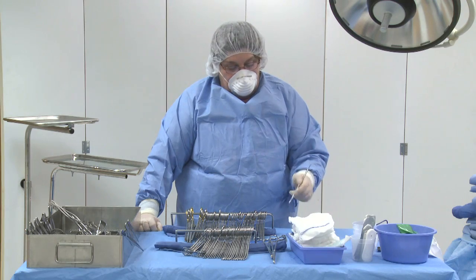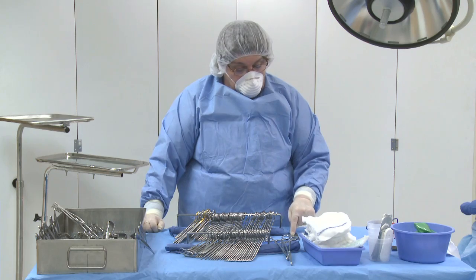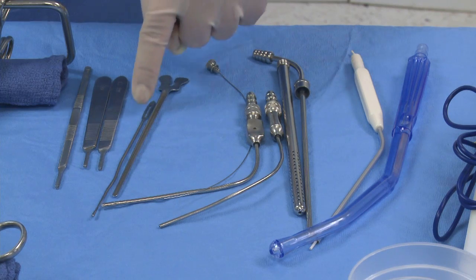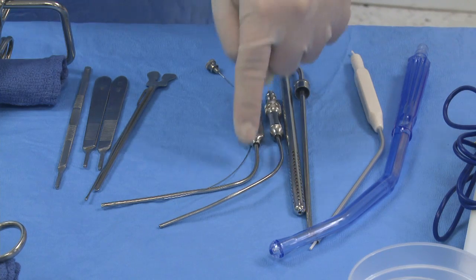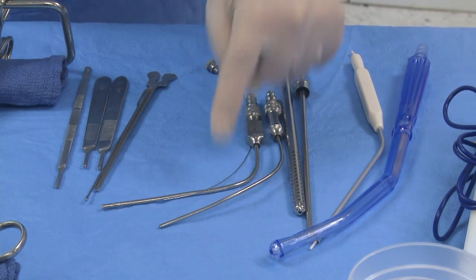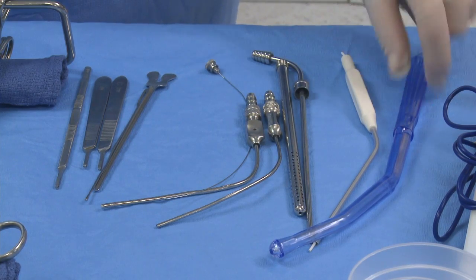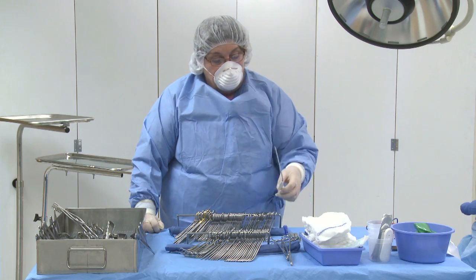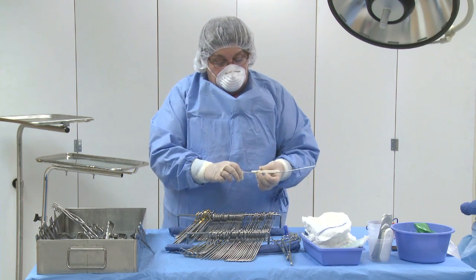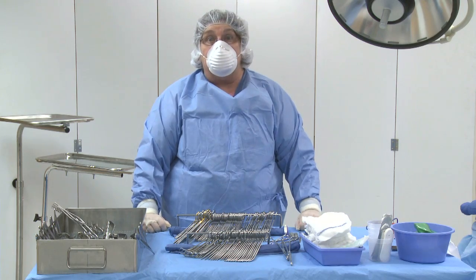Now we're going to count the rest of the instrumentation. You have 1, 2, 3 knife handles. The probe and the groove director. The two Frasier Neuro suctions with stylet. The pool suction with two pieces. The two disposable suctions. The plastic Yankauer suction. And the plastic Neuro-Frasier suction and the stylet. And we have completed this lesson.